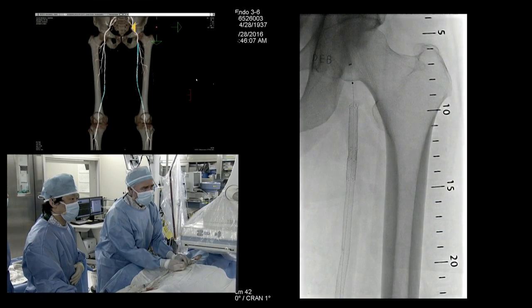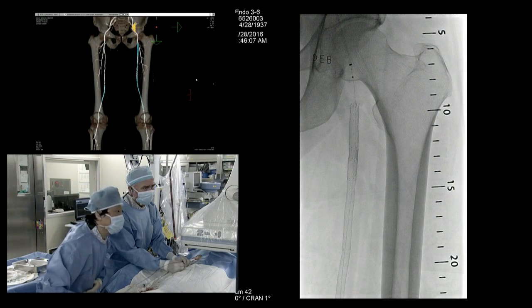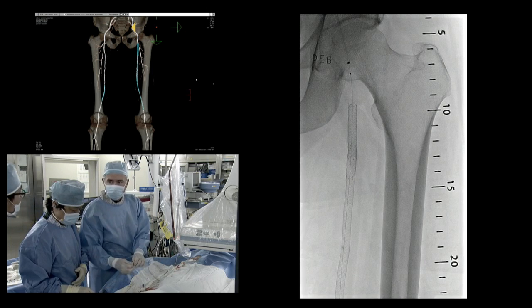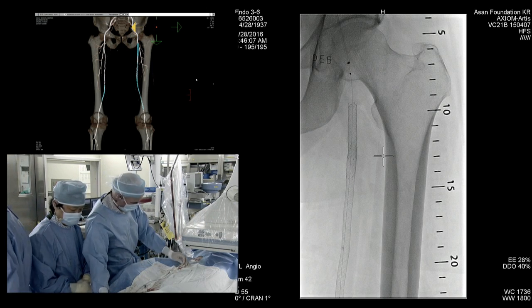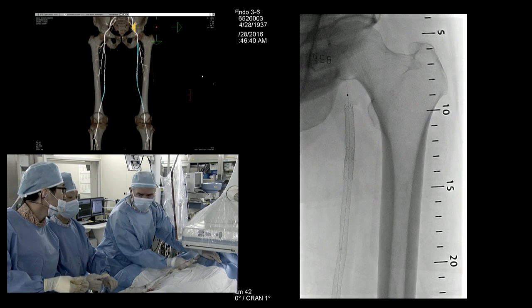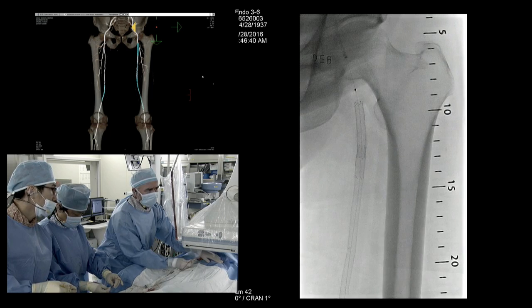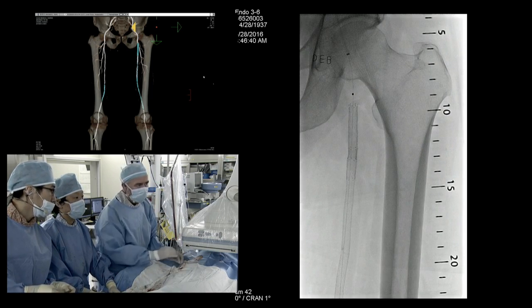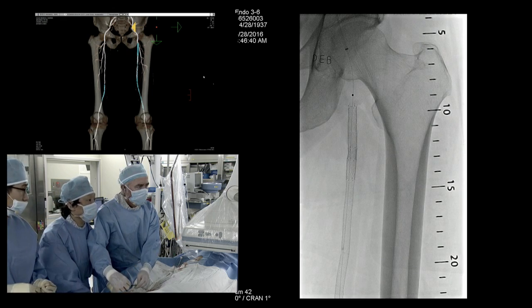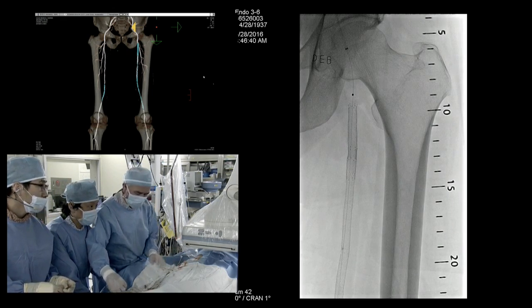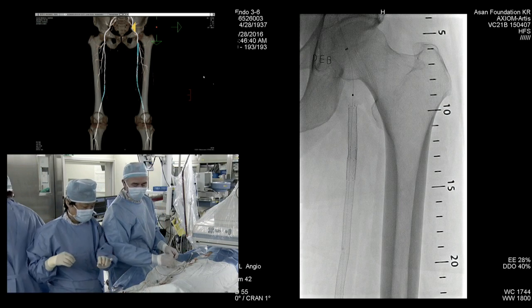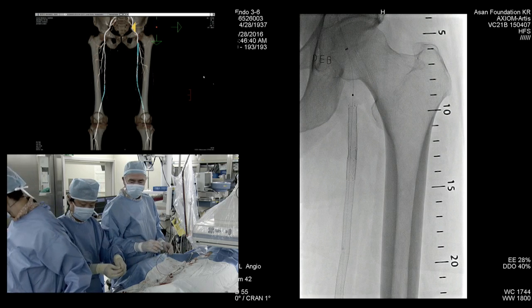Here's the downside of using a 0.014 wire — we're catching on that proximal stent. We're just going to switch our wire. A U-shaped Terumo wire would probably go down really well. What I typically do is push my 0.014 wire in further for wire bias and push it off the stent struts. We hate to have that balloon sitting in there too long — ideally you want to get it down to the lesion within three minutes.